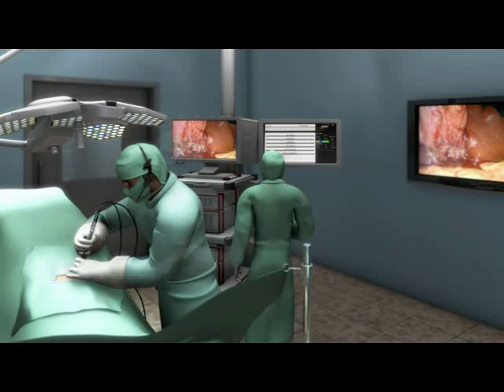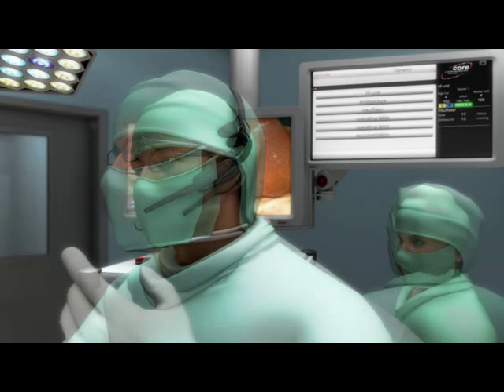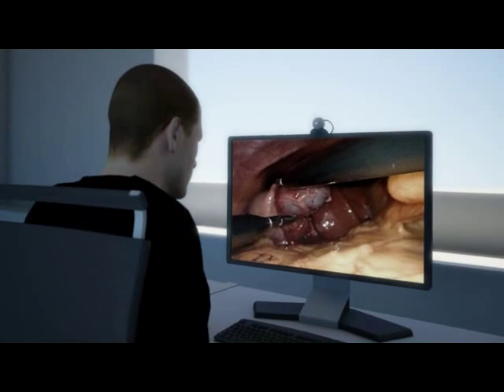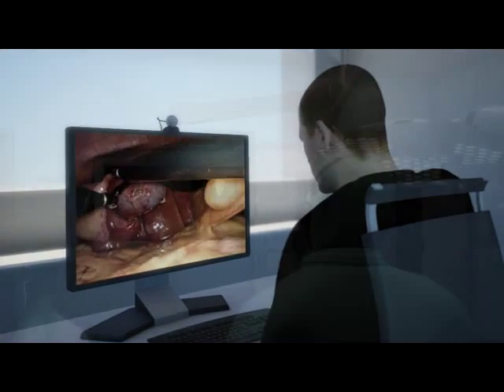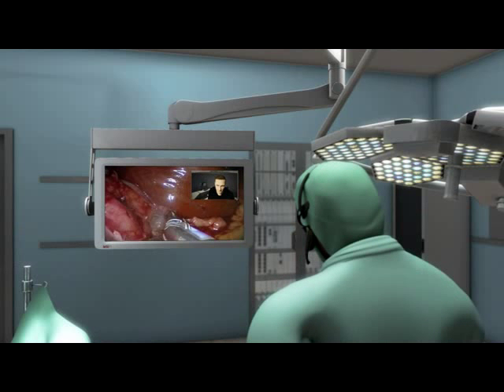The same problem has occurred in the Core operating theatre. The appropriate specialist is initially informed by phone. On the nearest available computer, the specialist can call up the live video stream from the operation via the network and get a precise view of the situation. The specialist advises the surgeon by video conference or teleconsulting.